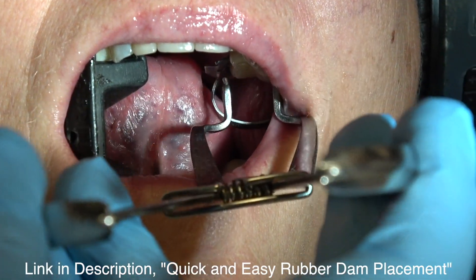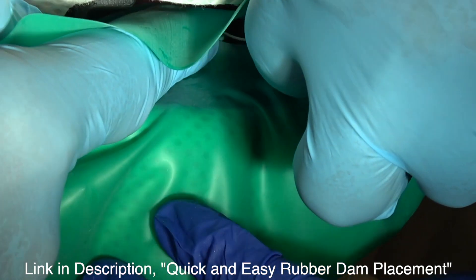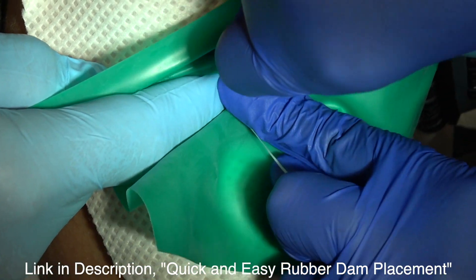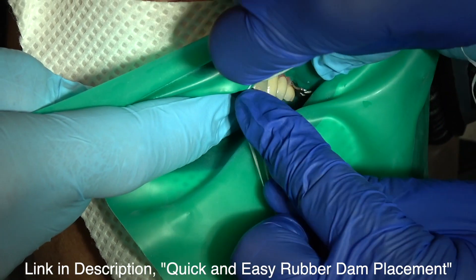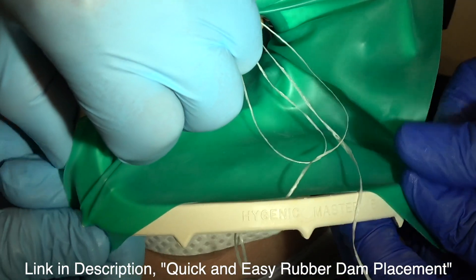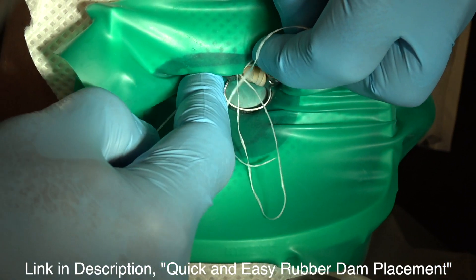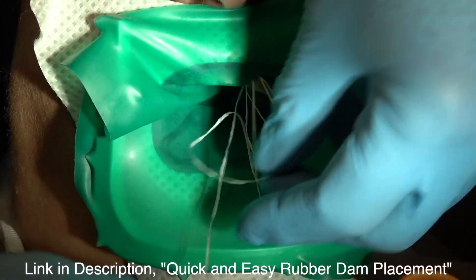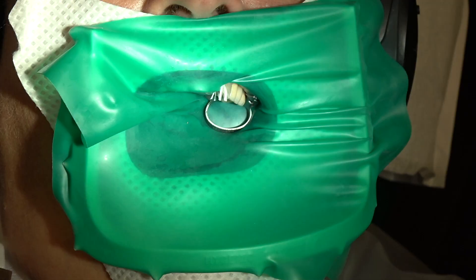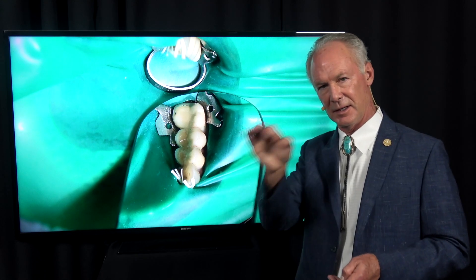I'm going to place a rubber dam with this technique that we use. Place a clamp on the distal tooth, then use that long hole and pop that between the tooth in front of the bridge. You can see here's our bridge — we've popped it here and we've got this long hole.